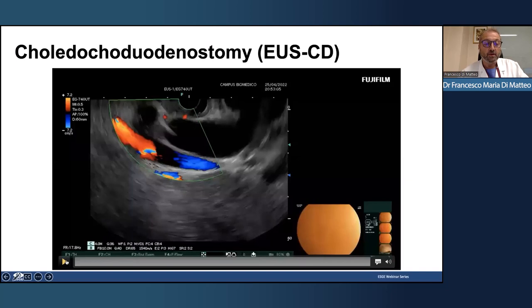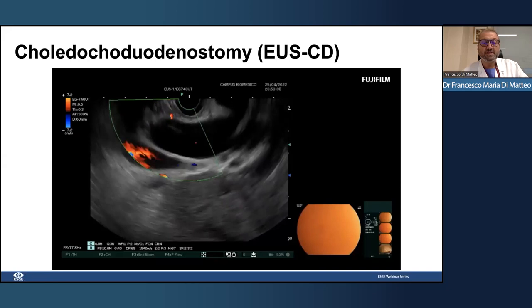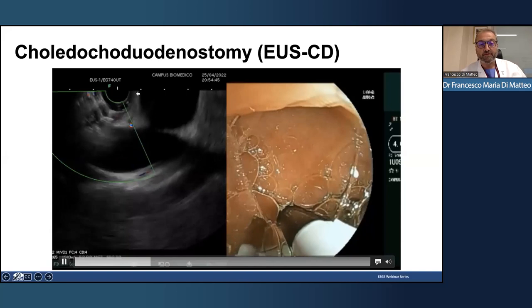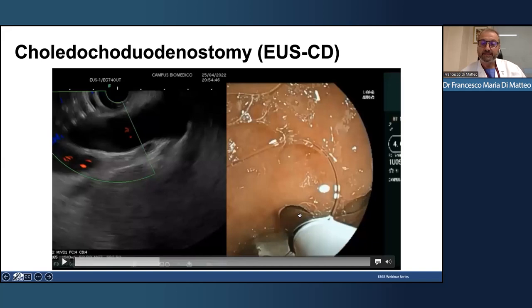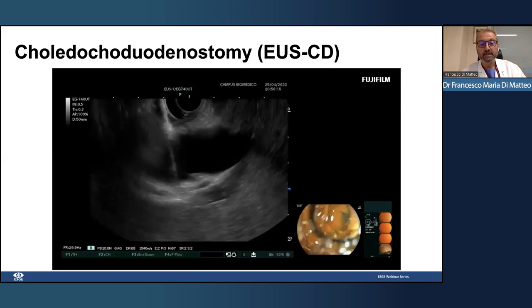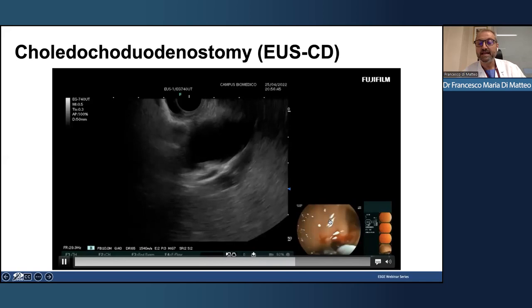This is another option, choledochoduodenostomy in malignant biliary obstruction. You can see it always with the new probe EG740. You can see something that with the previous probe we didn't see so very well. And this is another very interesting particular: the distance between the exit of the device and the probe is lower. And in this procedure in particular, it is very important that the distance is minor, because the excursion of the lumen-apposing metal stent is not so wide. So it's very important. That is a nice feature that we appreciate a lot. This is the amazing image after the procedure.